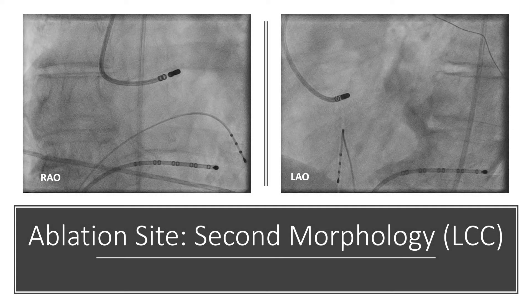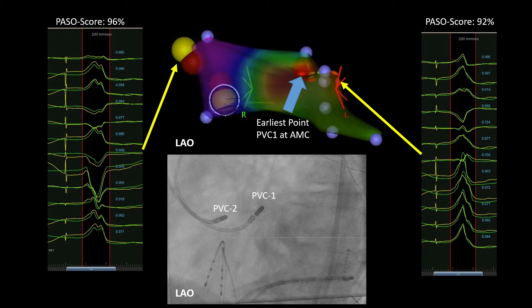RAO and LAO projections in this figure show the successful ablation site of the second morphology in the left coronary cusp. In this final figure, we see the successful ablation sites of both PVCs in the 3D mapping system, along with the best pacemap of the first PVC at aortomitral continuity and the second PVC in the left coronary cusp. In superimposed fluoroscopy images, we see the successful ablation site of the first PVC at aortomitral continuity and the second at the left coronary cusp.